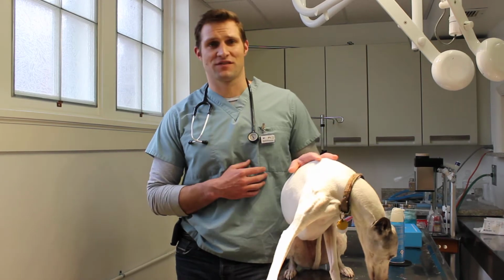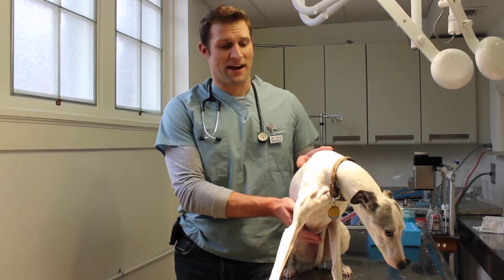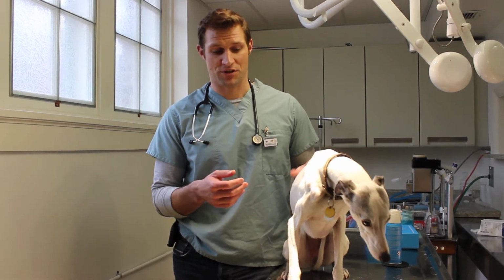For the purposes of this video, we have Bombay here, and Bombay has a small skin tag that we're going to remove today. But the great thing about this procedure is that, again, it does not require general anesthesia. We're doing this in one of the surgery suite areas in the hospital, mainly because we have good lighting, but I want to emphasize the point that we don't need general anesthesia for this procedure, which is fantastic.